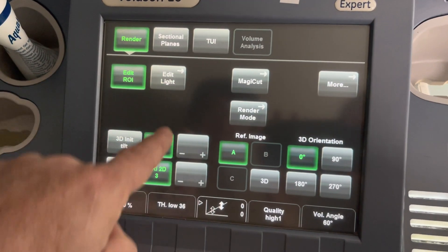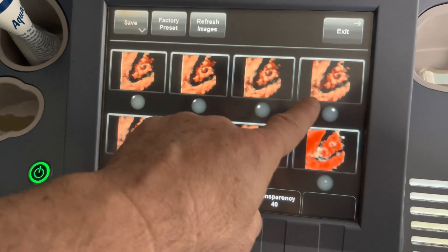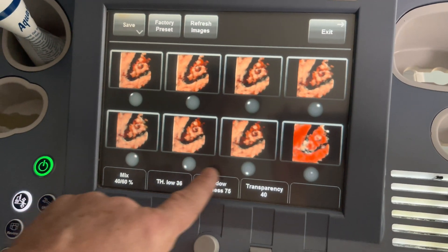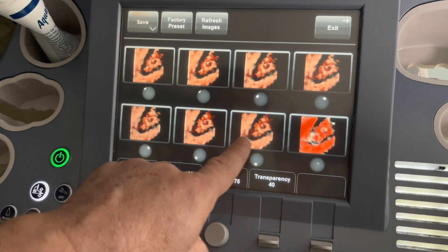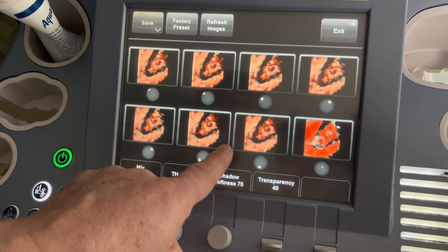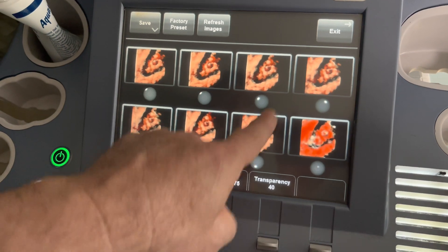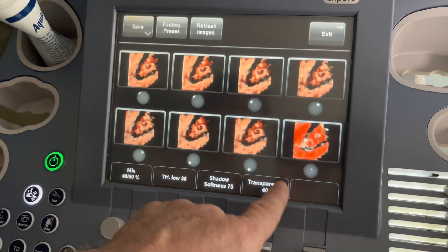In the Edit Light menu, I have different ways that I can use the virtual light, and depending on that, it can be centered or positioned in different directions.